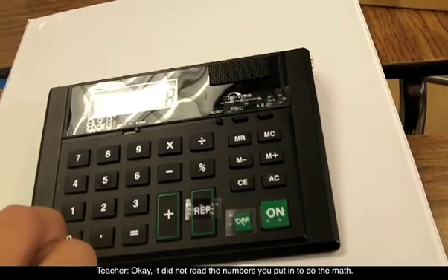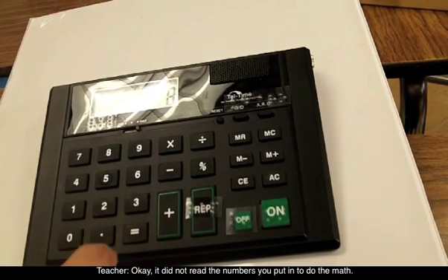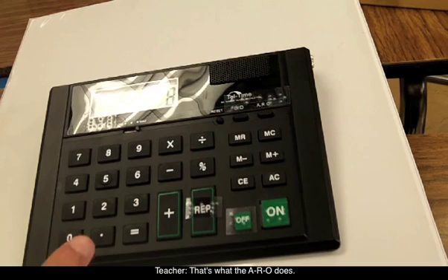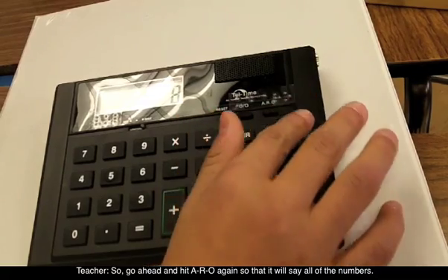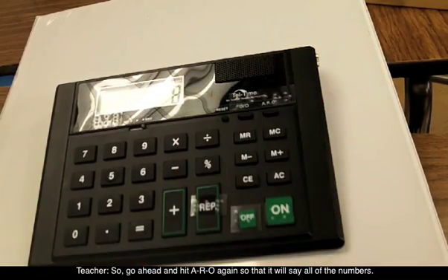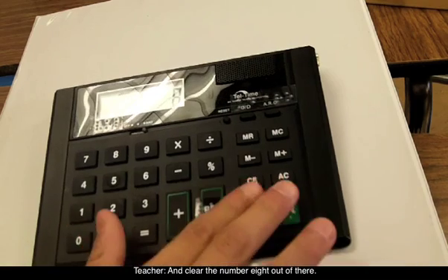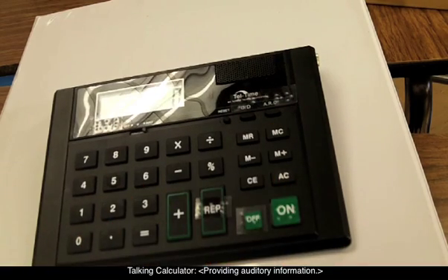Equal. Eight. It did not read the numbers you put in to do the math. That's what the A-R-O does. So go ahead and hit A-R-O again so that it will say all the numbers. There you go, and clear the number eight out of there.